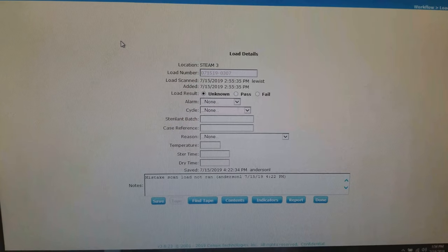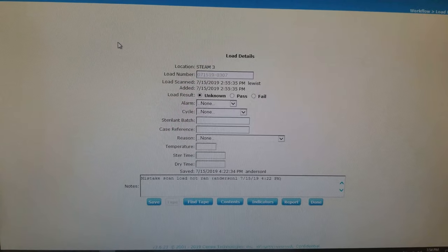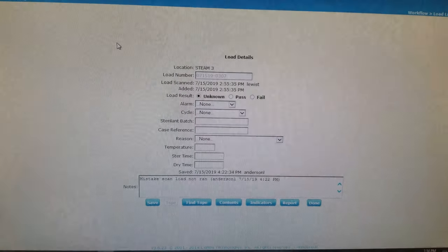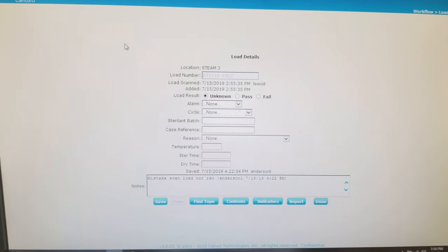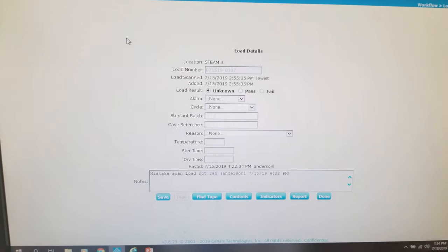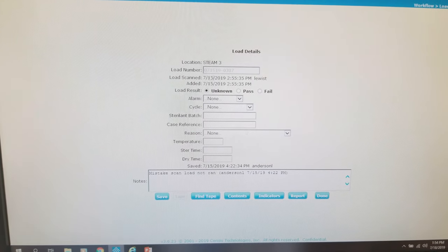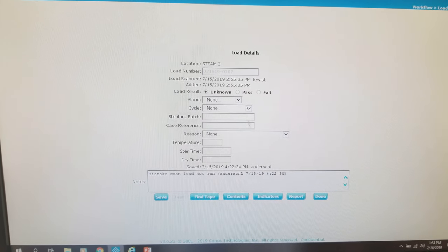Greetings SPD. Today we're going to load our sterilizer results manually as our fine tape option is not currently working.